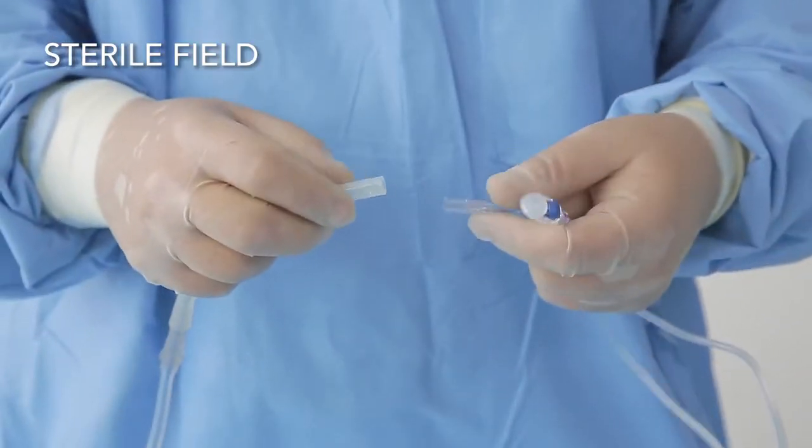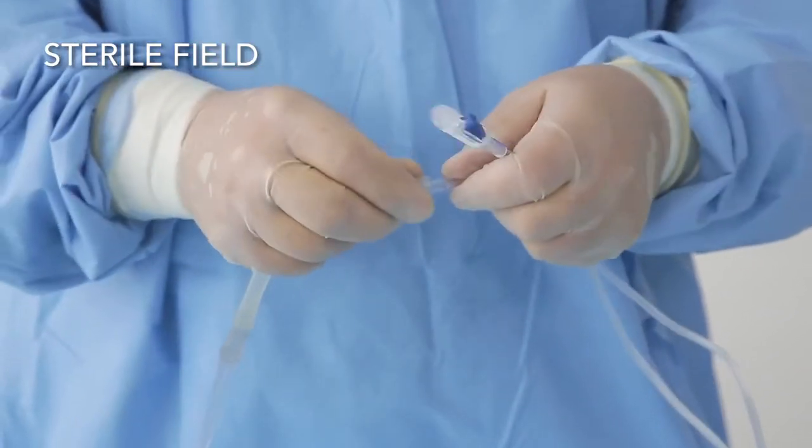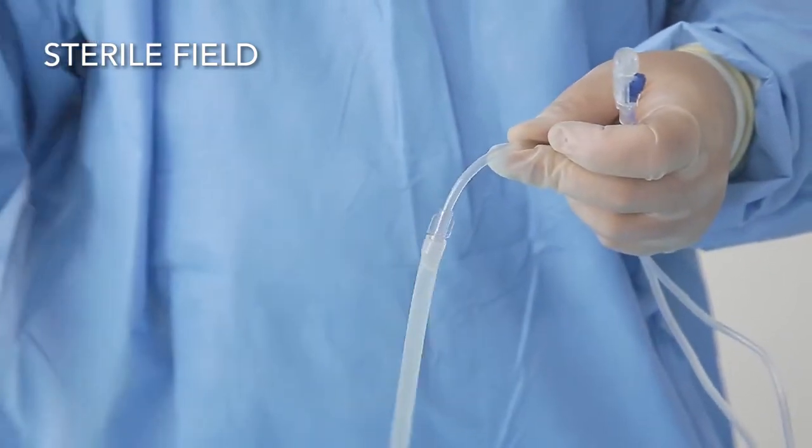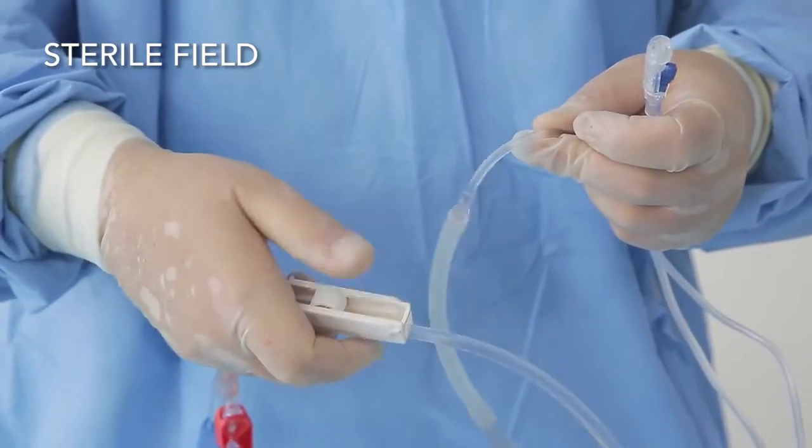The sterile assistant or urologist now attaches the water source to the female luer lock connector and opens the roller clamp for water to flow.